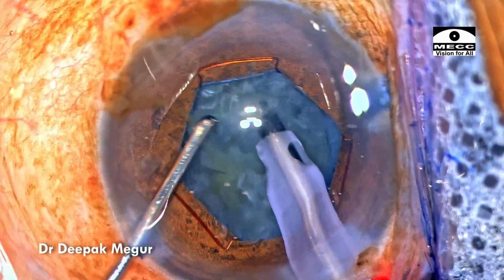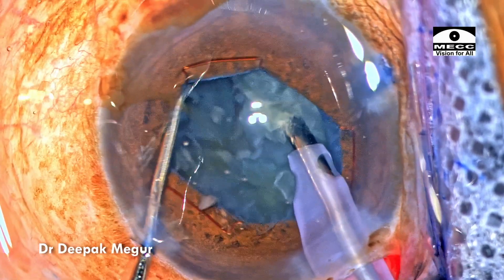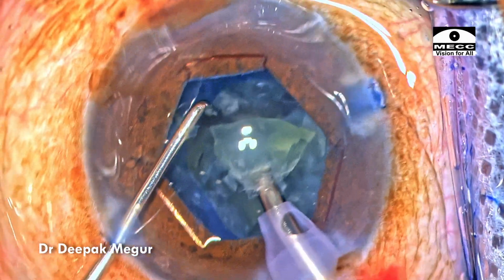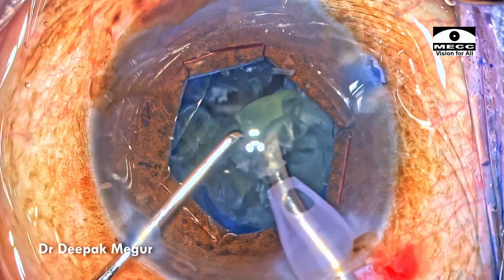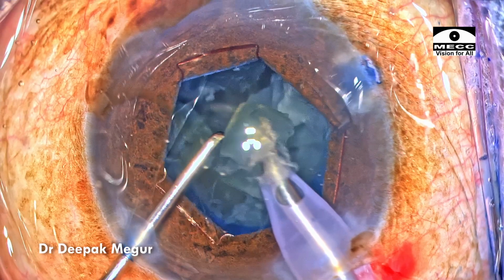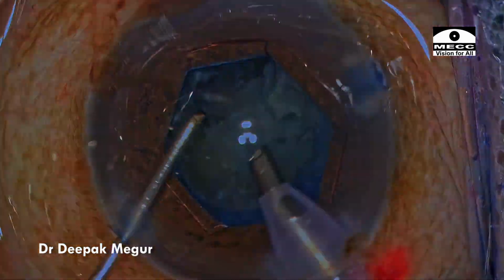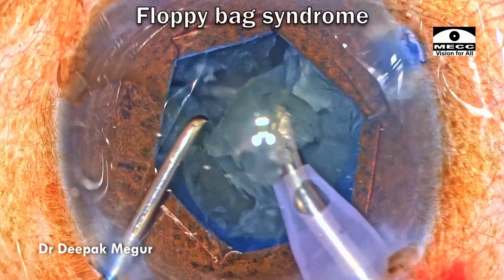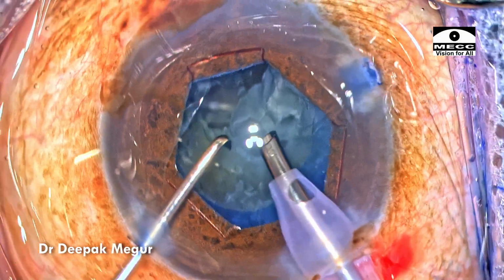The nucleus is being divided using the vertical chop technique, and the first fragment is freed and pulled out of the bag and then emulsified in the antechamber. As the fragments are being emulsified, the underlying bag is wobbly and it's dancing around, as is very obvious. This is floppy bag syndrome. This is what I like to call these sorts of capsular bags.